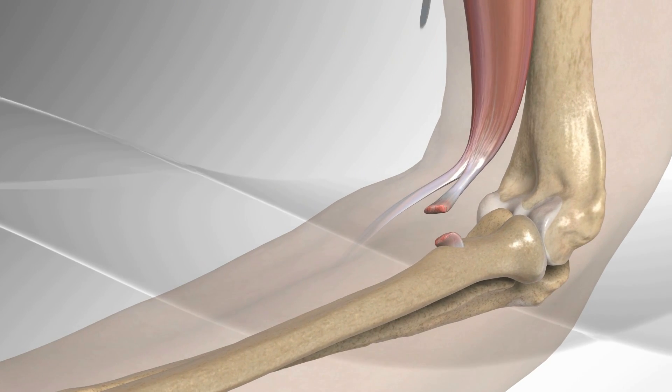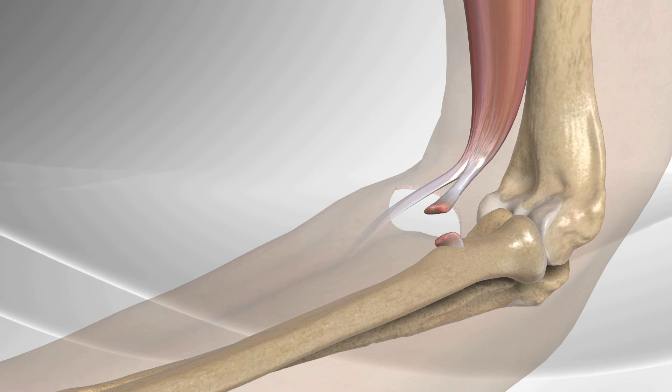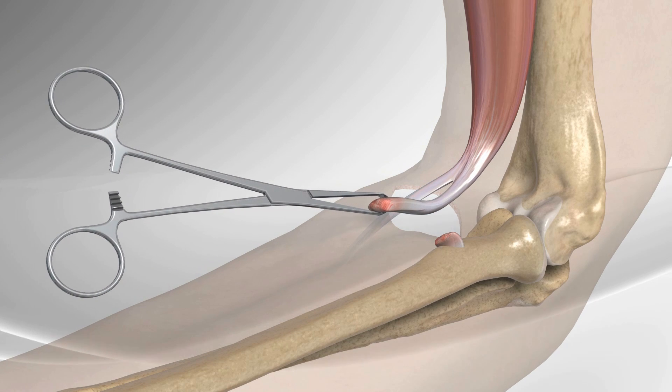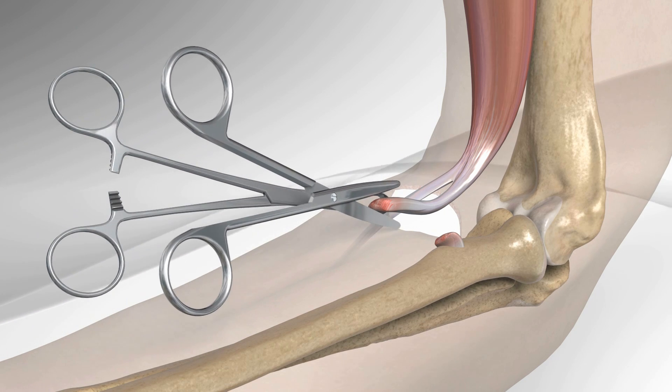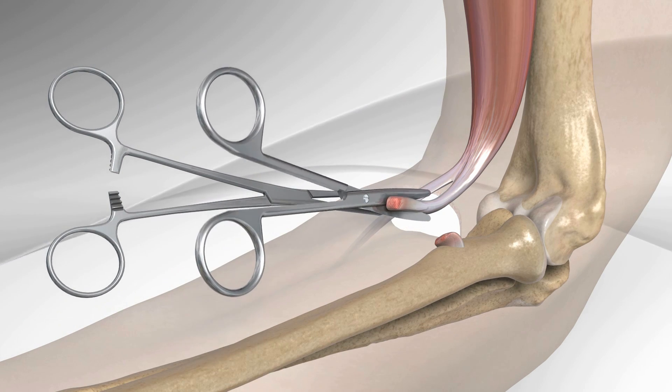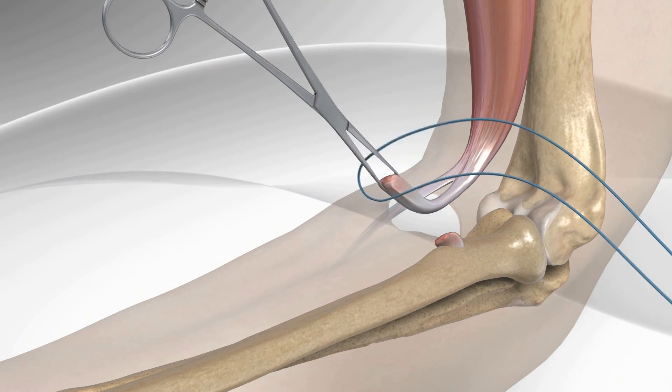An incision is made over the skin in the area of the distal biceps attachment near the elbow. The biceps tendon is identified and liberated, bringing it slightly out of the incision. The tendon is repaired by removing any weak or degenerative tendon, and the end of the tendon is sutured using a baseball stitch technique.